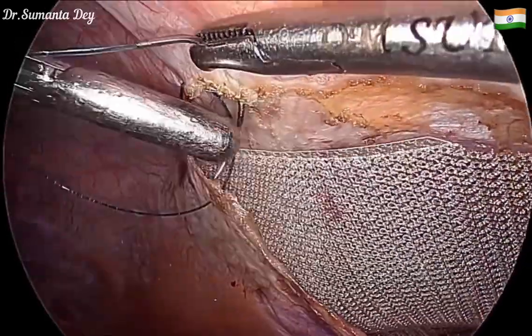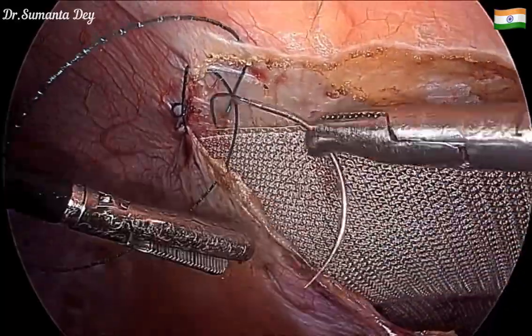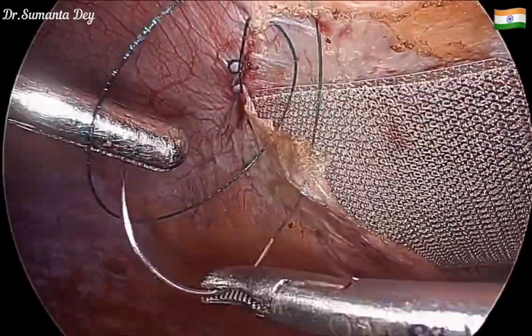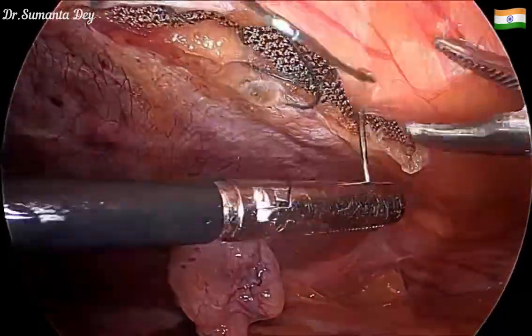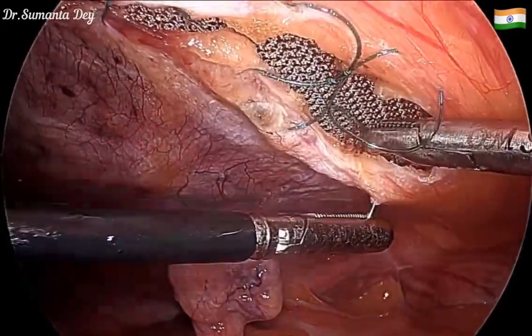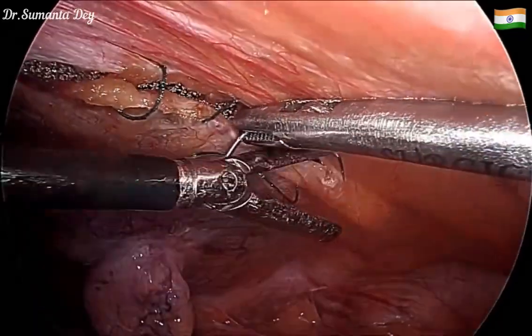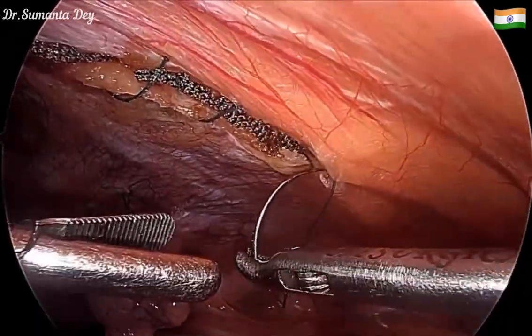While closing, I decreased the pneumoperitoneum pressure to 10 mmHg, which helps with nice closure of the peritoneal flap and also during defect closure. That completes the peritoneal flap closure. This patient had an absolutely painless recovery and was discharged within 24 hours from the hospital.